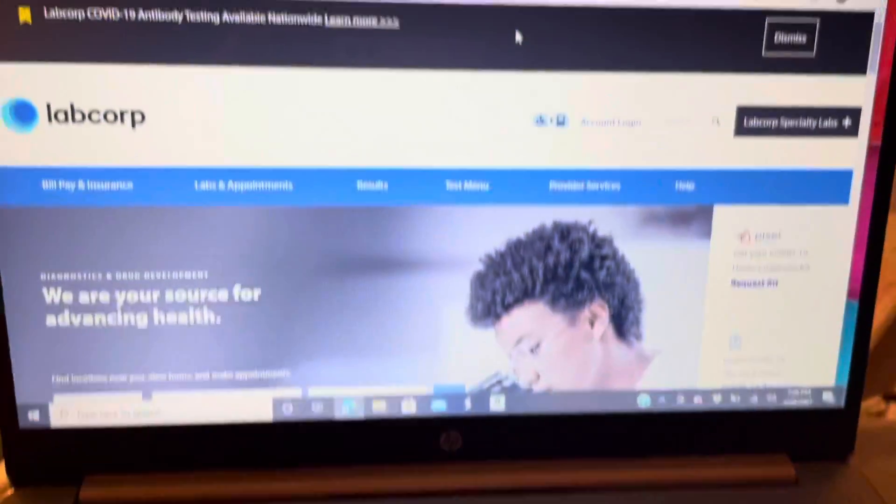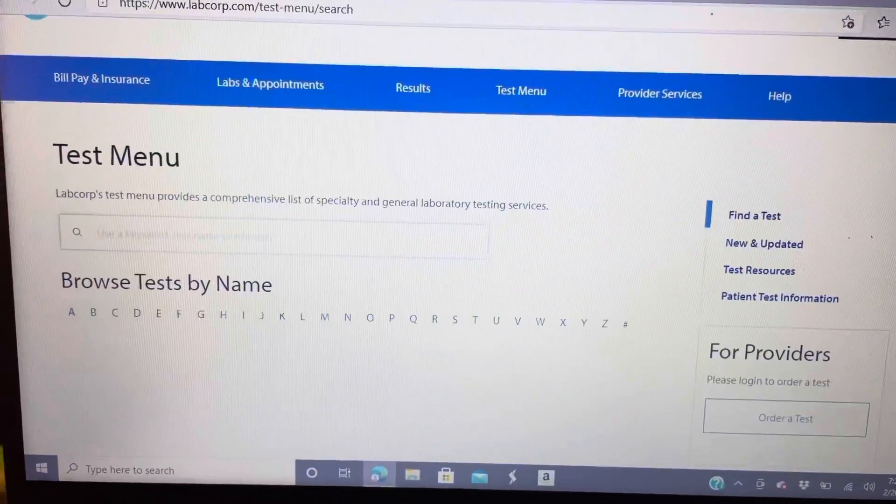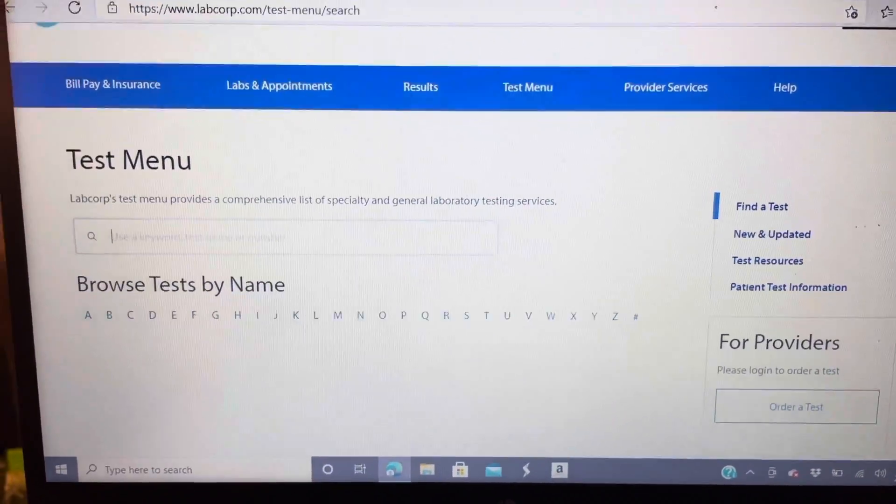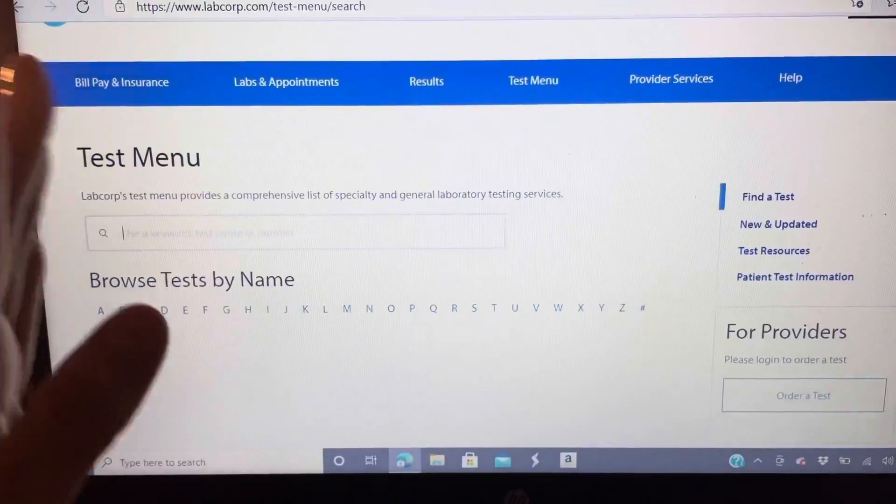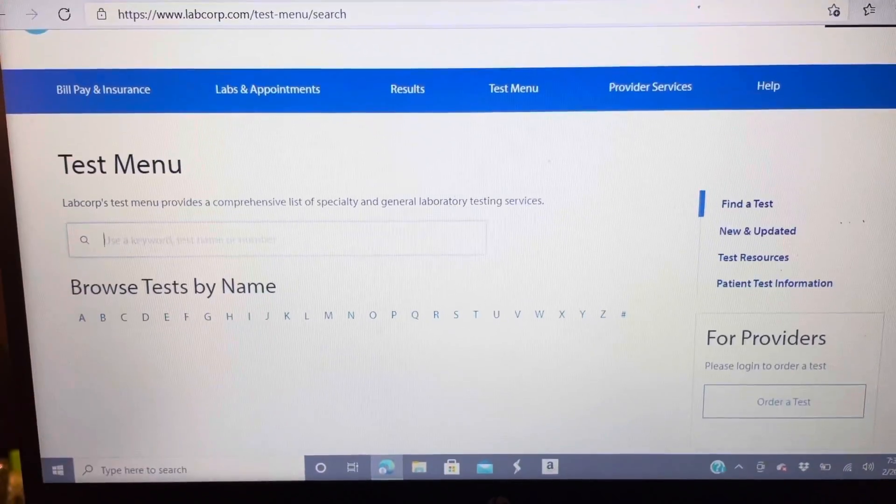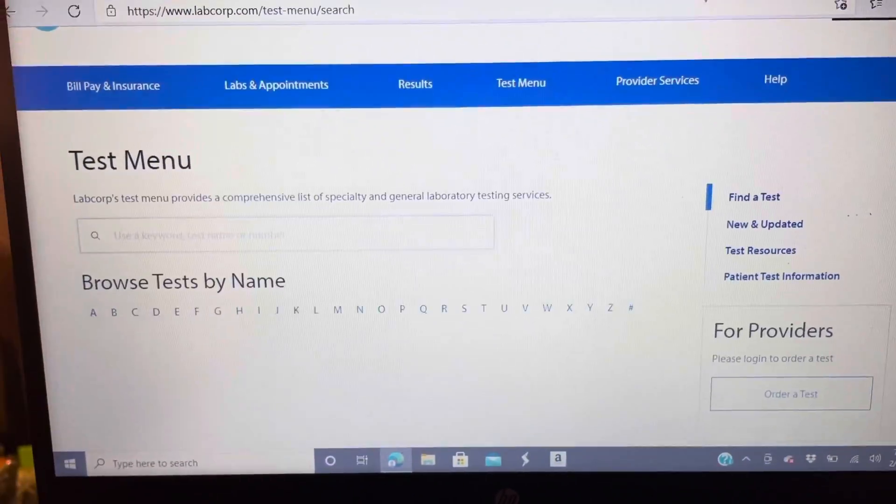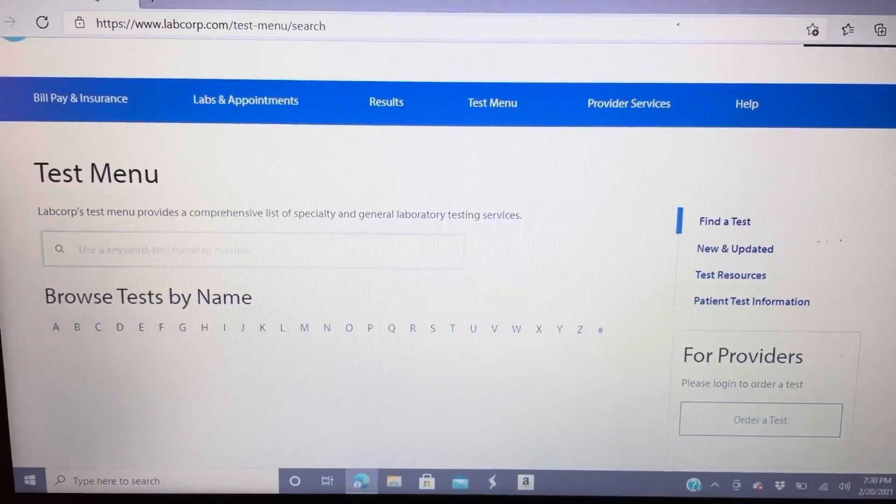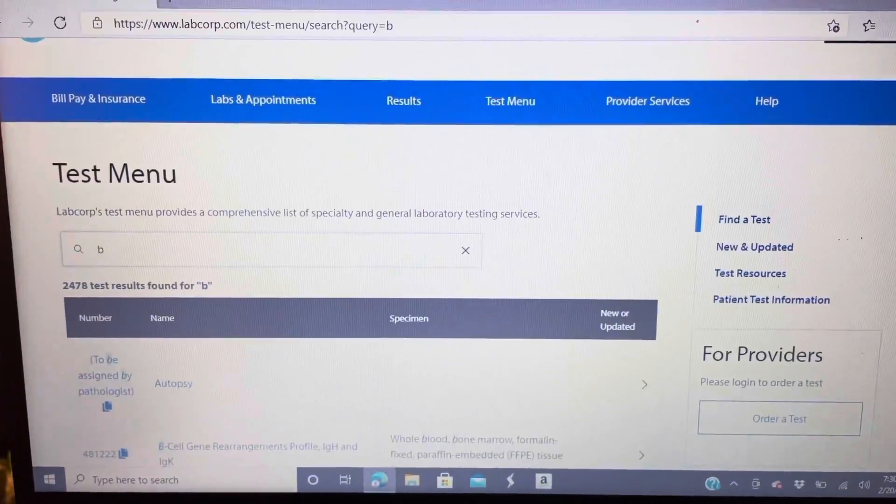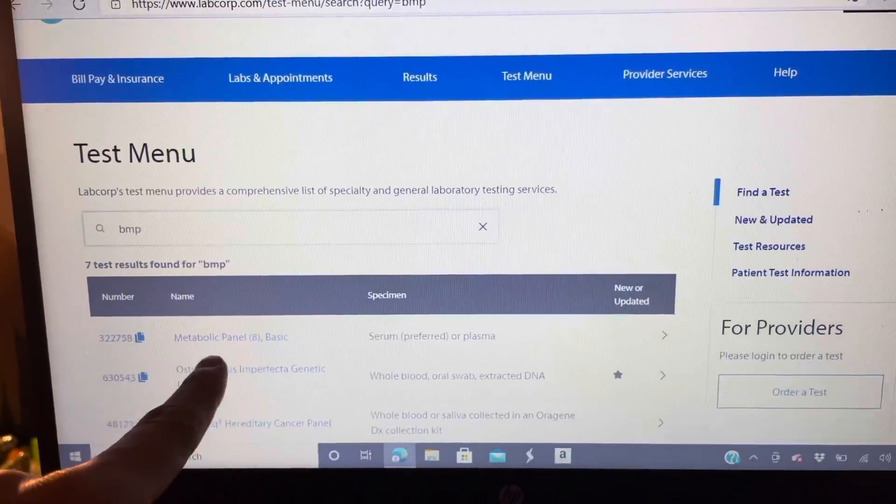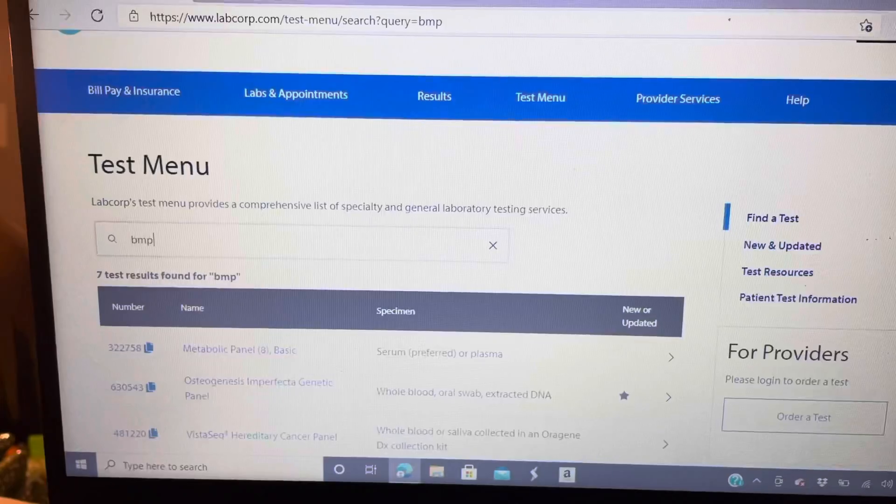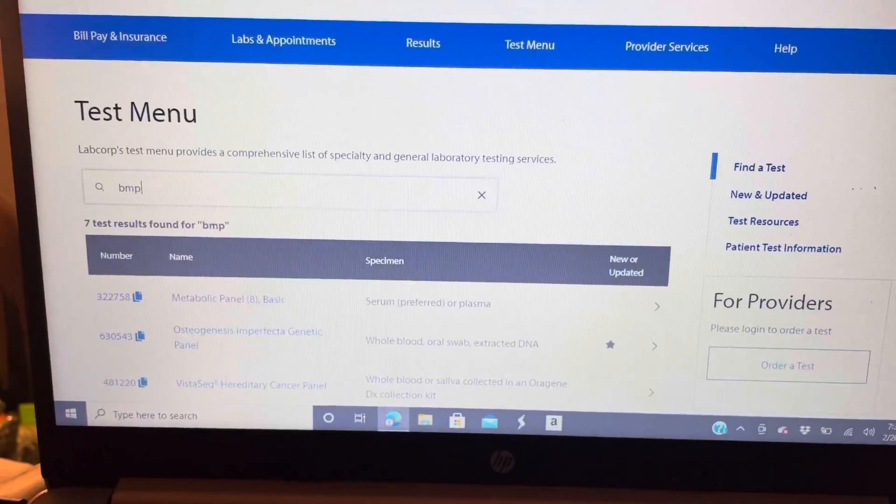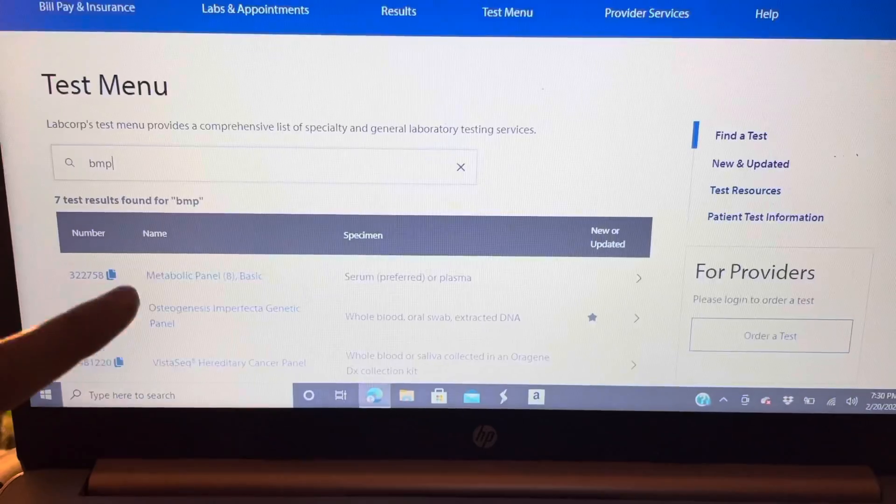I'm on the LabCorp website. After I hit test menu, it brought me to this test menu page. You can browse test by name or you can type in your test. Let me do a common test like BMP and see it pops up.